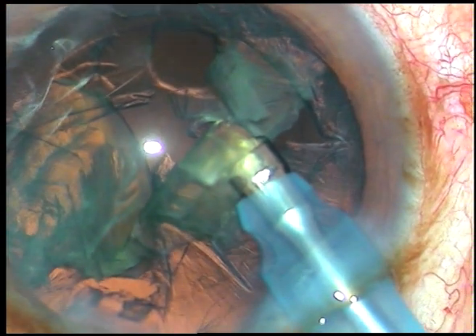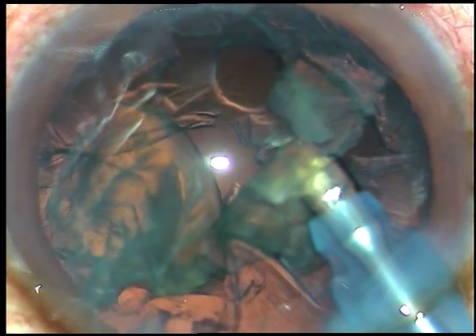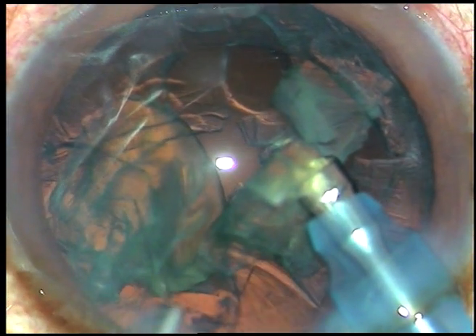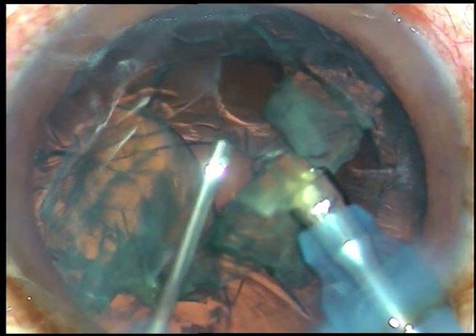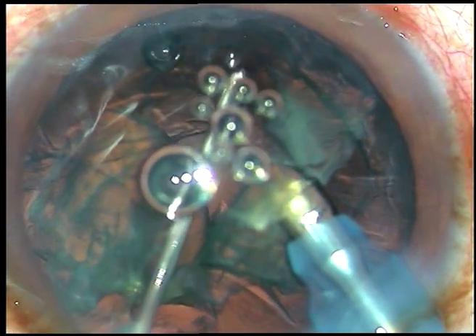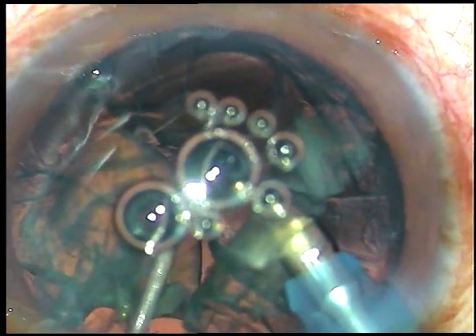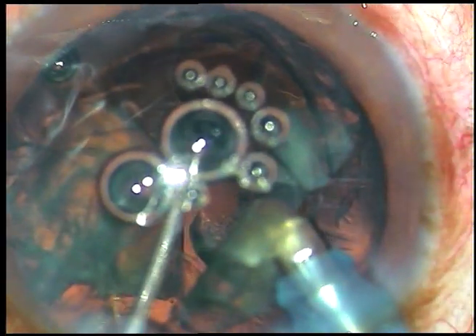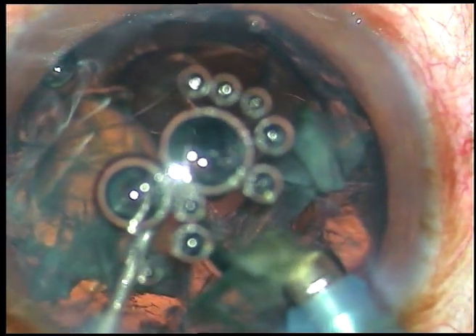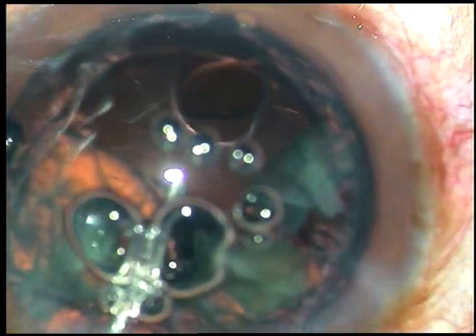So I wait and ask for viscoat. I plug this rent with viscoat from Alcon, and then I remove the tip of the FACO handpiece.